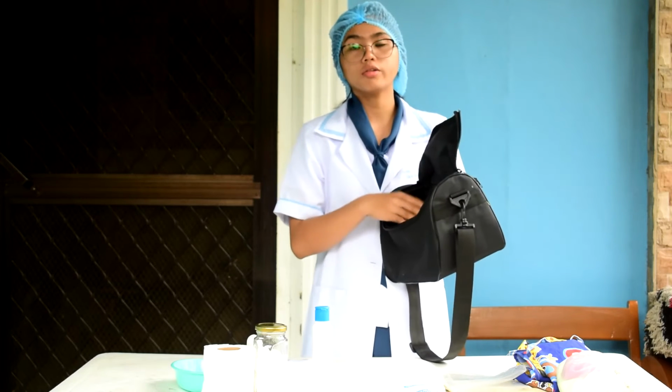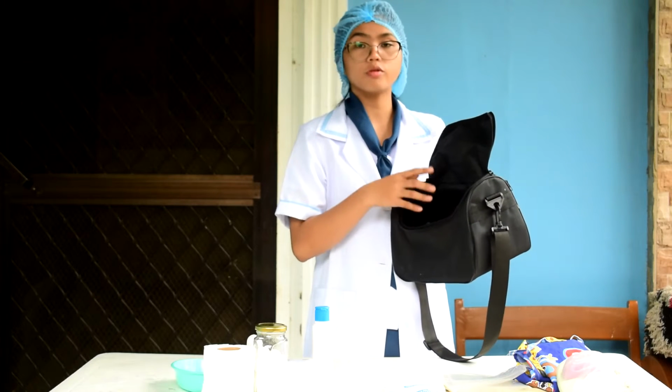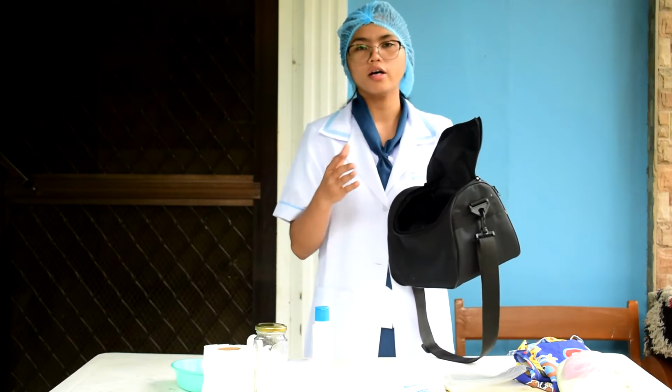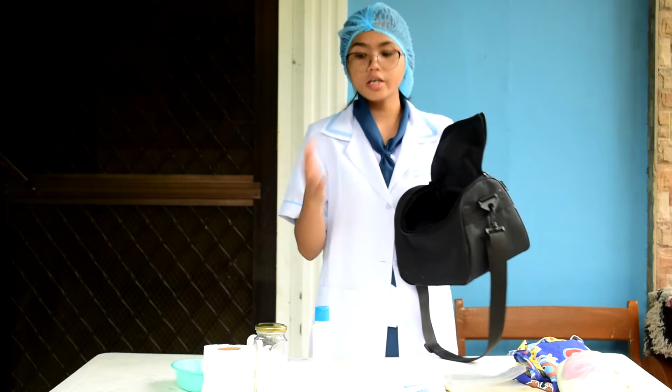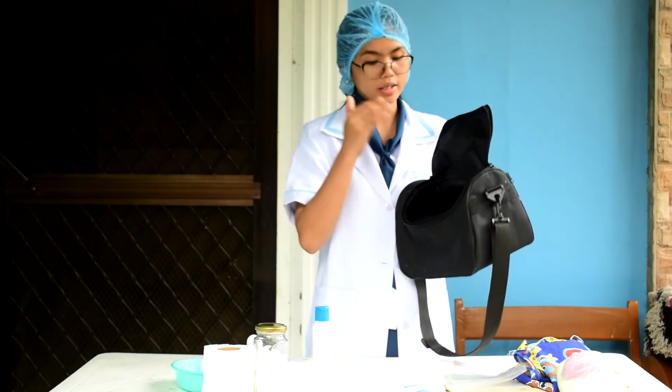So for the content of the bag, on the front side, from left to right, you have to place them in proper sequence. Your thermometer includes your oral, rectal, or digital thermometer, your syringe and needles, and metal container if possible. And then on your left side, you have to place your medicine glass and weighing scale.